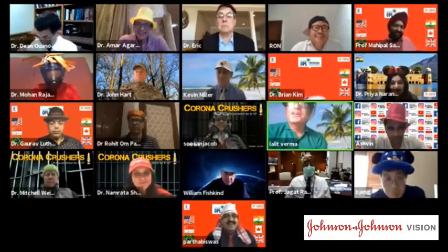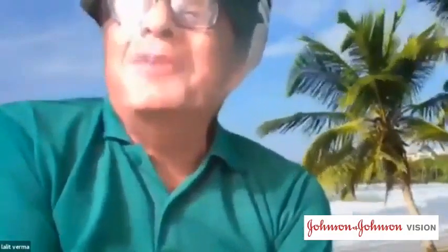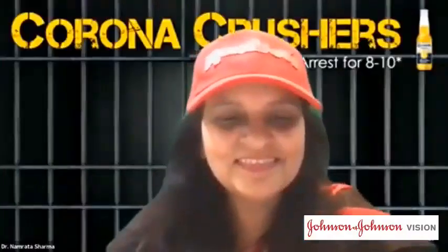See, I am a retina guy, but I sat all across 2.5 to 3 hours just seeing that all the instruments which we have innovated, you people can't do your surgeries or can't exist without that. So it's a happy feeling for me. Even though there were not many retina videos, you see Mahipal presenting chandelier, and Namrata and Susan Jacob taking the use of air pump. Without that, all these PDEK will fail. Believe me. Happy to see this actually.